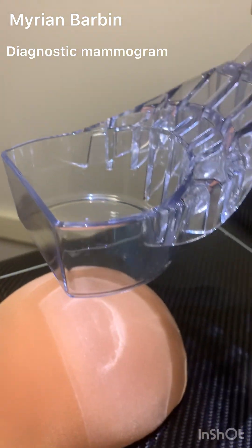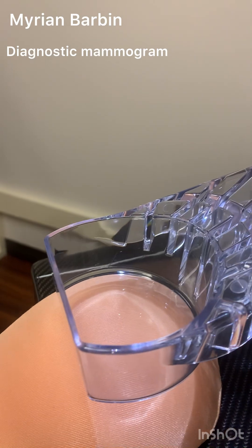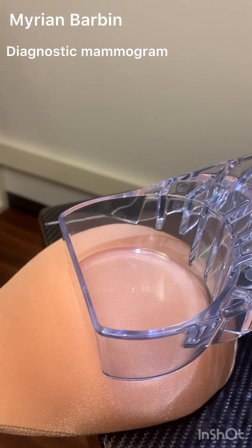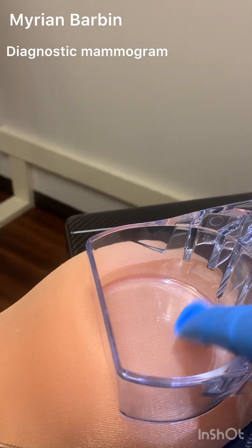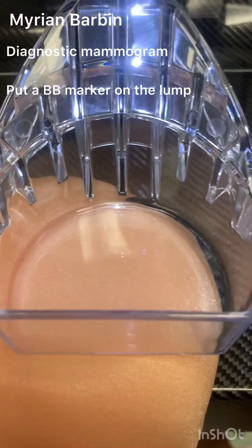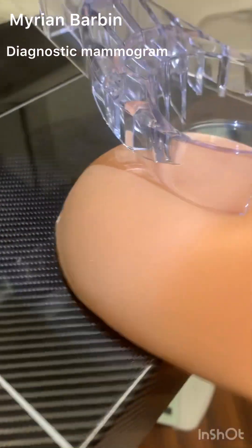Check your prior diagnostic or screening mammogram images. Also make sure that the patient has their prior images if they are coming from another clinic, so that you can know where you are going and what area of the breast you are looking at — which clock position, whether it is 12, 3, 6, or 9, and how many centimeters it is from the nipple.